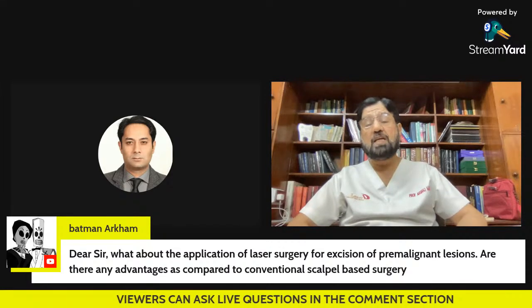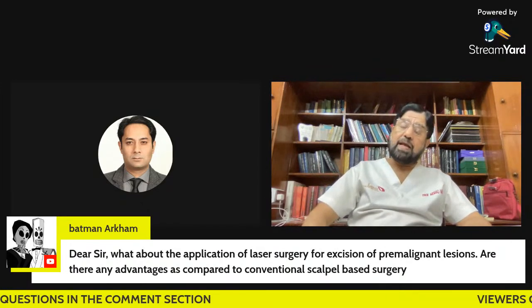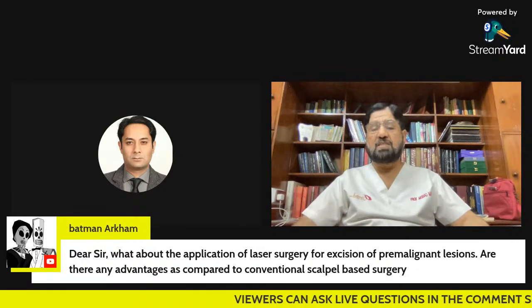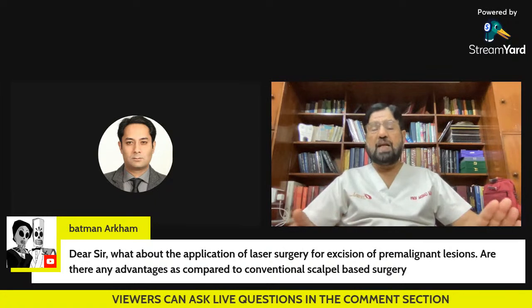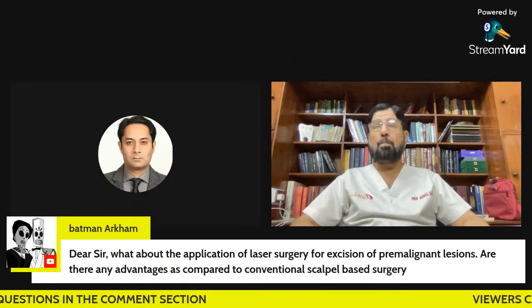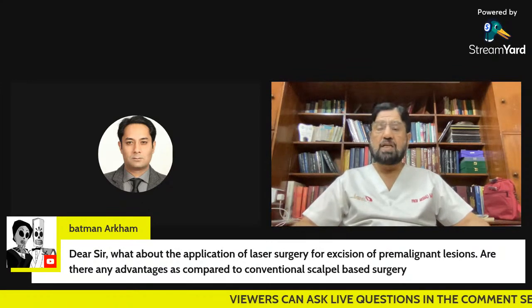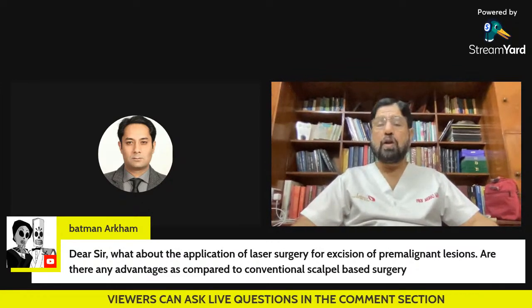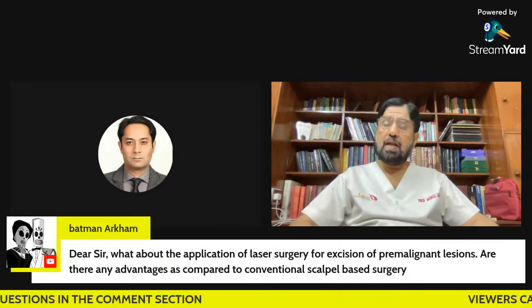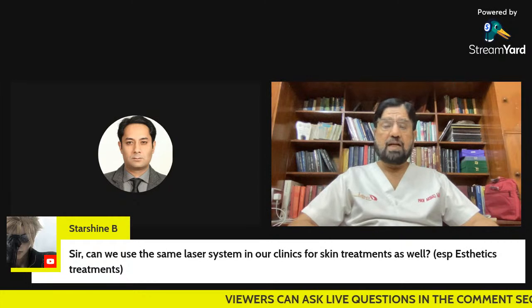So you cannot ablate the whole of the oral cavity by the laser, and you make it like this. However, if you want to ablate this type of lesion, you have to go step by step. For leukoplakia, if there are no aggressive changes in the biopsy, you can say that it has no more atypia or dysplasia, then you can go for the laser use. That is no doubt about it. It is very promising in the pre-malignant area.